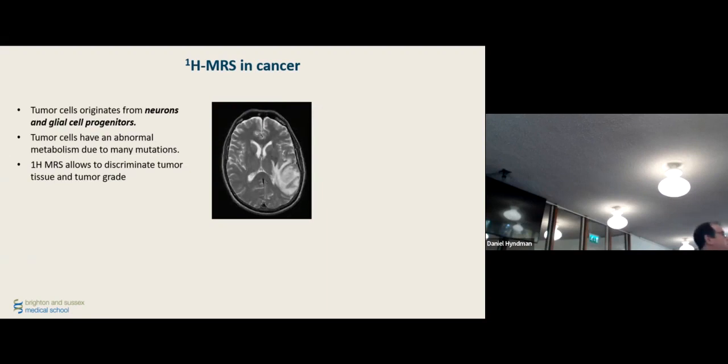One of the major applications is in cancer. What I'm going to show you here is a relatively ancient application, a characterization of standard spectra. These days, actually, MRS is one of the unique tools used for diagnosis, follow-up, and treatment of a very specific metabolite that we did not mention here. It's 2-hydroxyglutarate, an important metabolite in phenotyping a specific type of tumors.